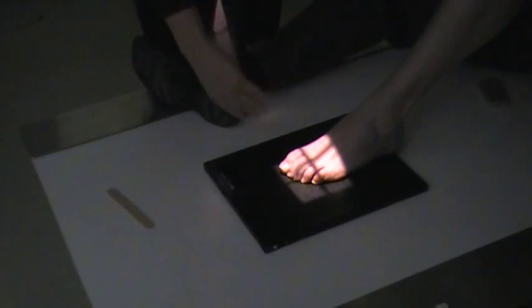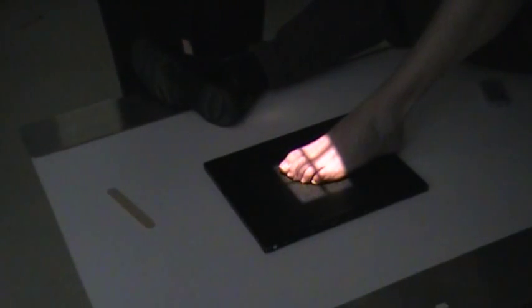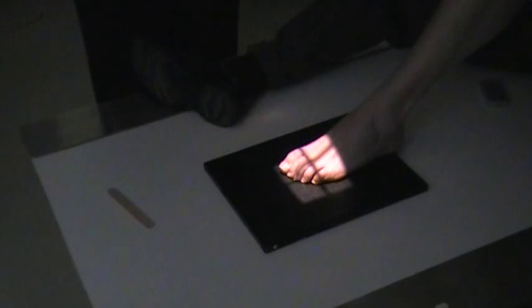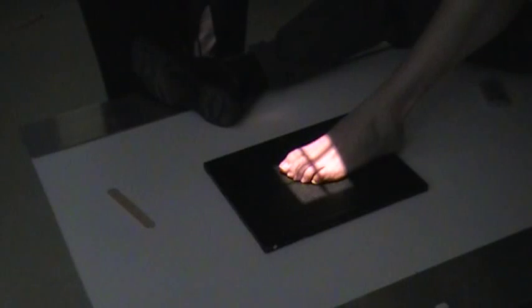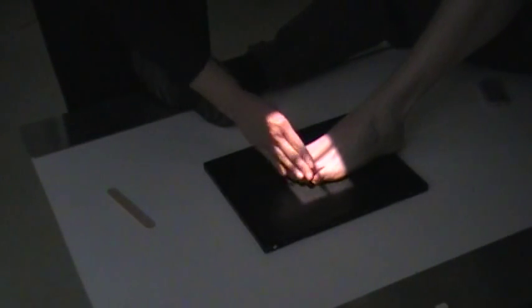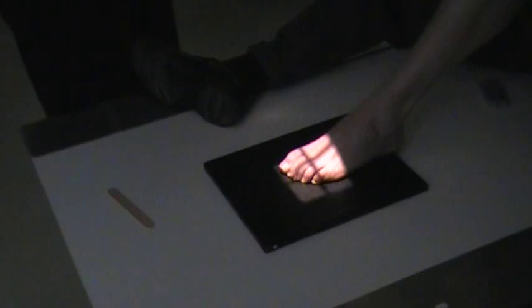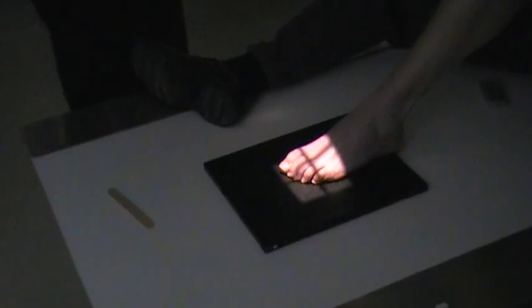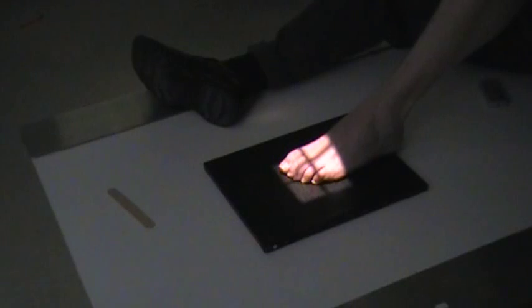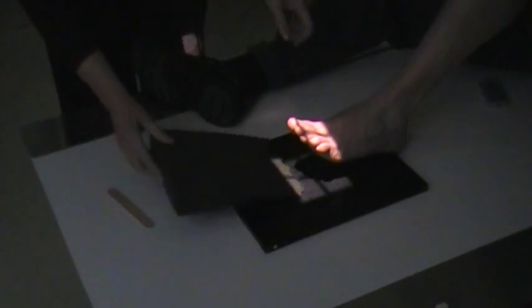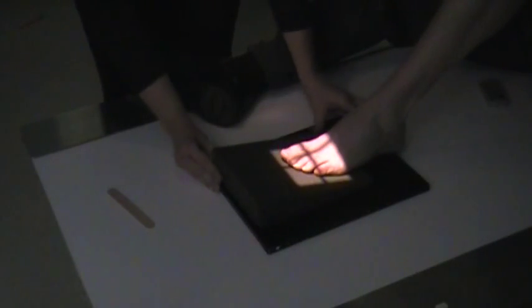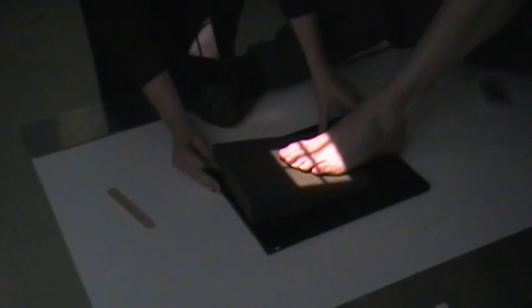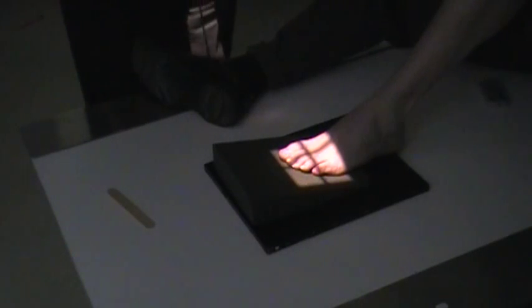Now you can include the entire digits on the AP, and you are going to have a central ray angle angling up towards the head at about 15 degrees. This helps straighten out the curve in the toes. An optional procedure you can do is actually put a sponge underneath the toes like this to straighten them out. If you do it that way, you don't have to have that angle anymore.